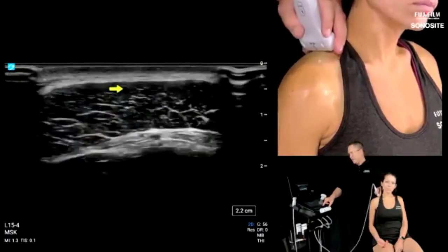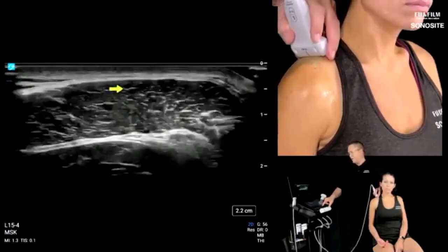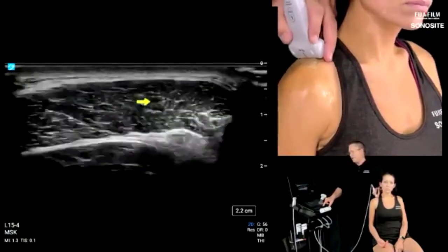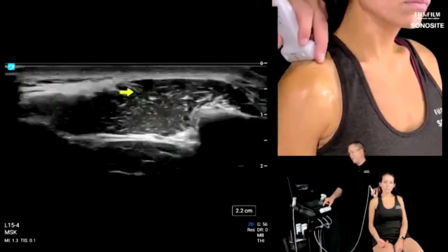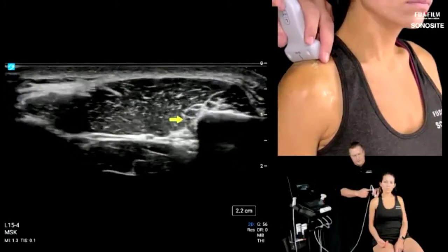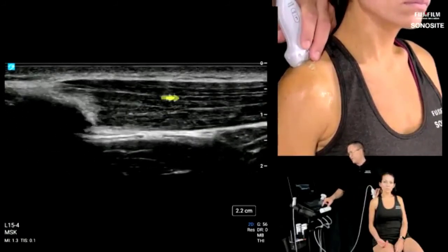We can scan the muscle belly and make sure those fibers stay centrally located in the screen. What you want to do is make sure that the fibers are not going oblique when you're scanning through this, because angle artifact can look like little areas of muscle fiber loss. But here's your trapezius, all of this up here, and then let's go long axis. I'm going to bring the left side of the screen lateral, and we're going to see the superficial aspect of what we scanned earlier today. So this is the long axis of the trapezius muscle here.